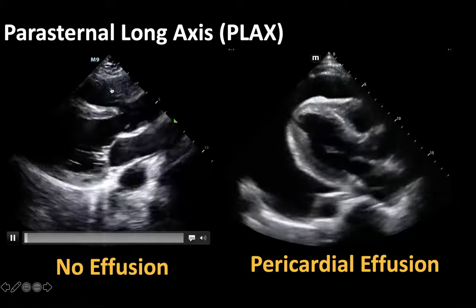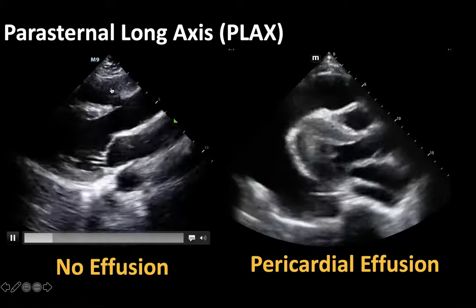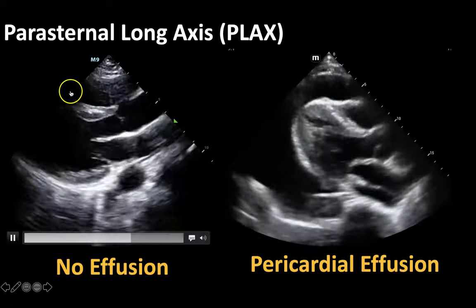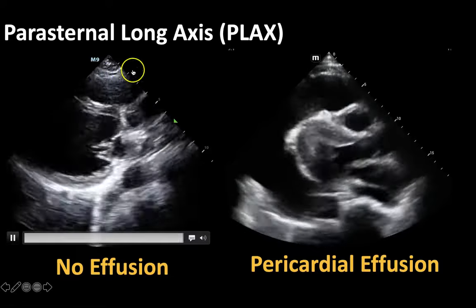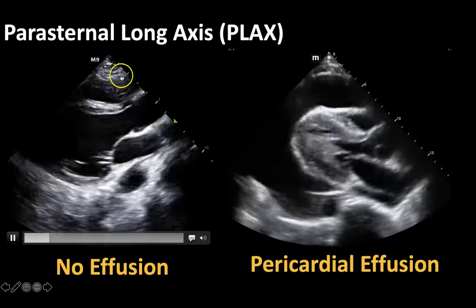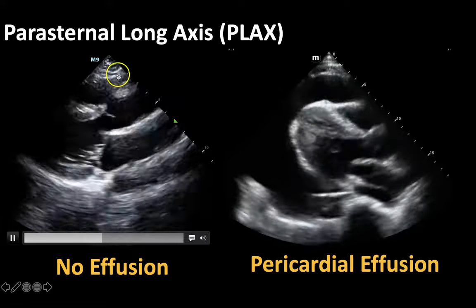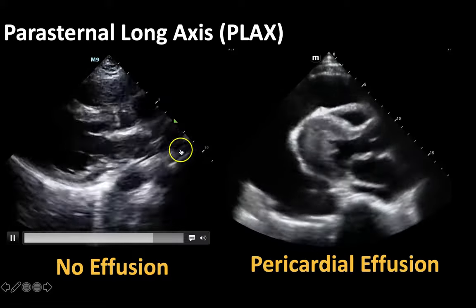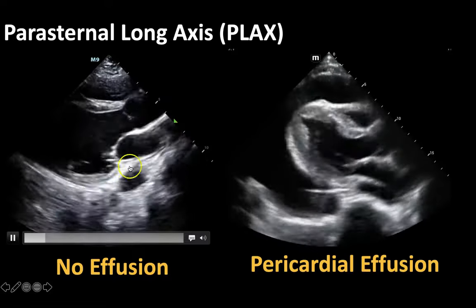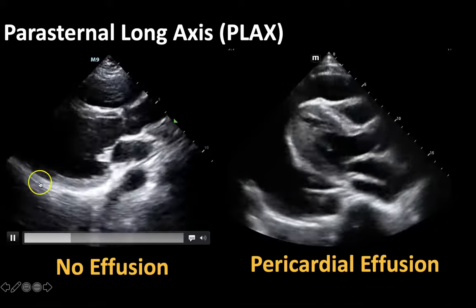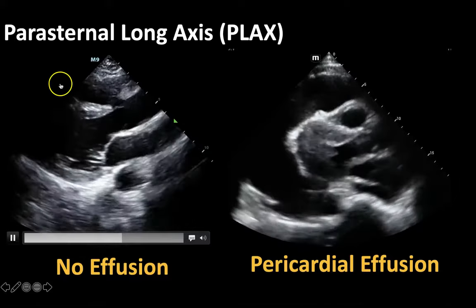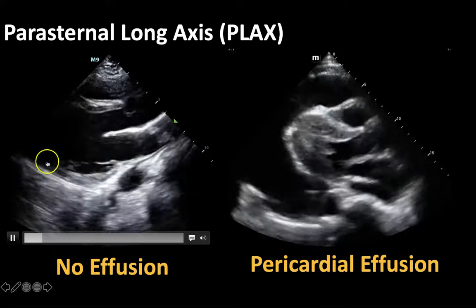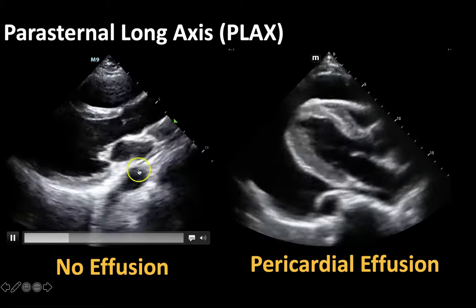We look anteriorly here for any black stripes, and then we look posteriorly — if there's any sort of circumferential effusion, we would see it back here. We don't see fluid in either space here, so this heart on the left side of the screen does not have a pericardial effusion.